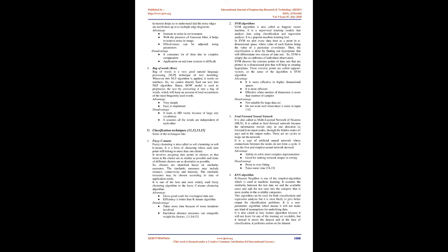2. Gray level co-occurrence matrix, GLCM. It is a statistical method that examines texture by considering the spatial relationship of pixels, and it is also known as the gray level spatial dependence matrix. The GLCM function characterizes the texture of an image by calculating the frequency of occurrence of pairs of pixels with a particular value and in a particular spatial relationship in that image, creates a GLCM, and then extracts statistical measures from that matrix. Advantage: excellent method for image texture analysis.